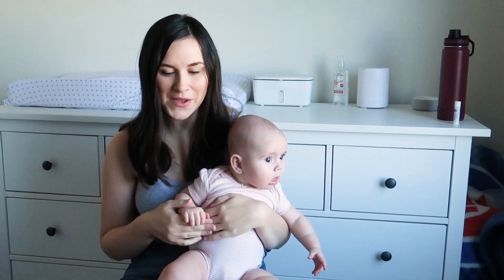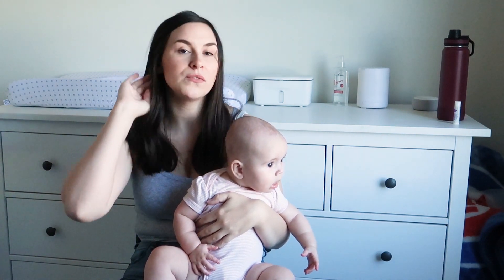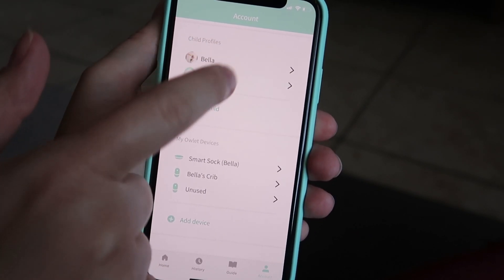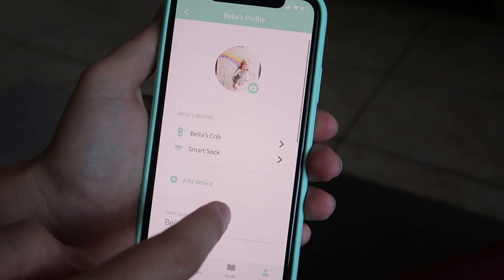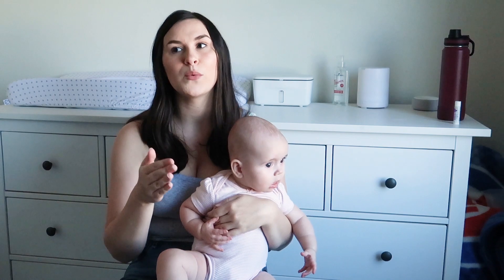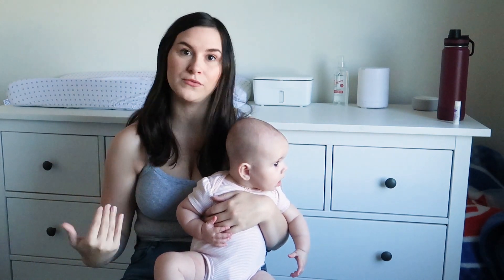Another con within the app being glitchy: if you have multiple cameras for one child, it works better if you set it up as if it were two different children. You're supposed to be able to have multiple cameras under one profile, but it often glitched and only showed one camera. For example, we had a camera over her bassinet in our room and a camera in the nursery over the crib for naps — switching between them was a pain, so you'll probably need to set up two different profiles.